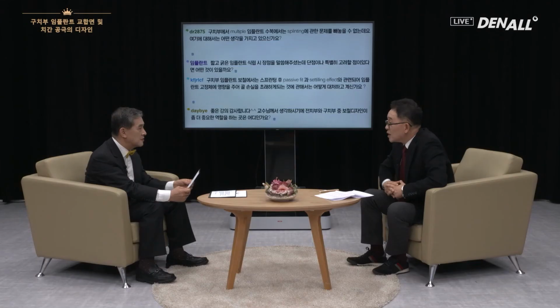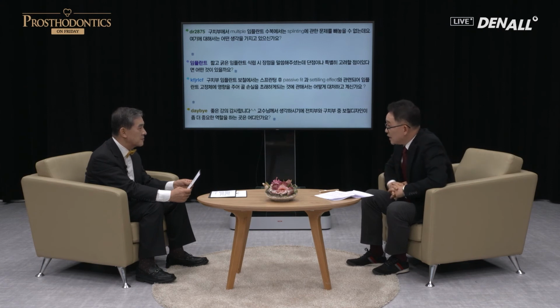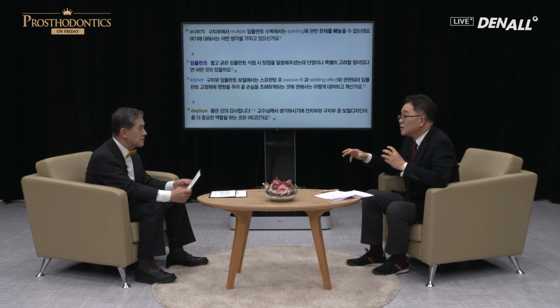Depending on the implant situation and oral environment, the dentist should make the decision. For example, if the bone is poor on the maxilla, splinting is the way to go. Depending on the situation, you need to use splinting or non-splinting. It's not that one is superior over the other. In the posterior region, if there's no problem in terms of aesthetics and biology, you need to splint them to distribute the stress over the framework.